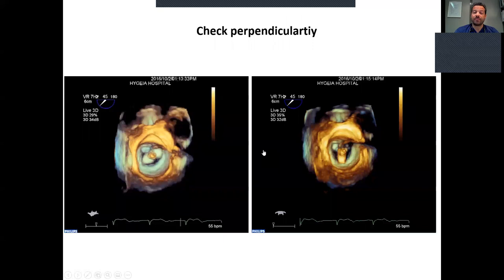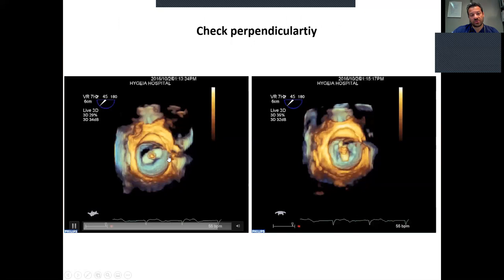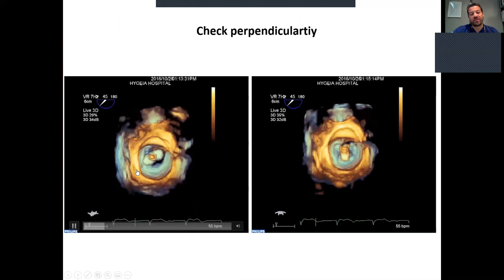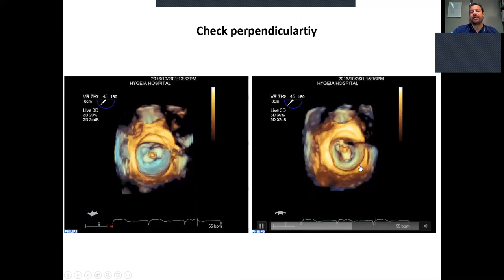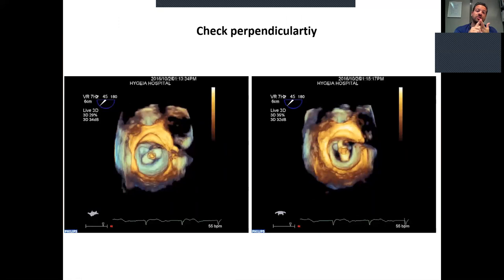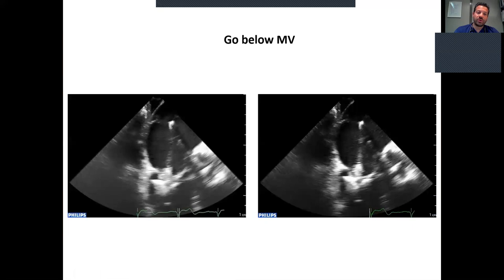The next step is to check perpendicularity. In the left image, you can see a Pascal device with the paddles open in the wrong direction — we must not go into the left ventricle at this angle. We have to turn the paddles counterclockwise in order to go perpendicular to the coaptation line. This is important to avoid distorting the valve after grasping and to grasp as much of the leaflets as possible.